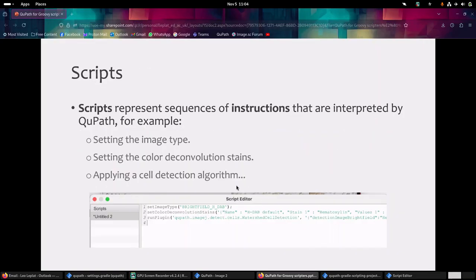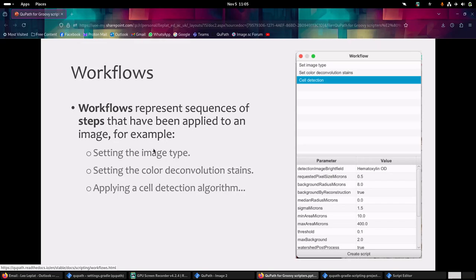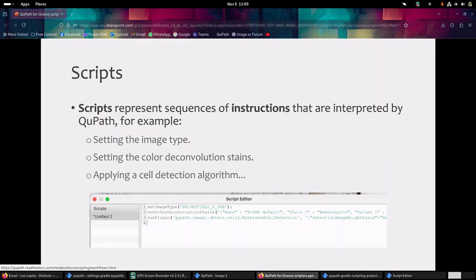So what is a script? A script is a sequence of instructions that are interpreted by QuPath - for example, setting the image type, applying a cell detection algorithm. This is quite similar to a workflow step, but a step is a more human-friendly way of describing some kind of analysis, while an instruction is a more computer-friendly way of describing an analysis - something QuPath can actually understand.